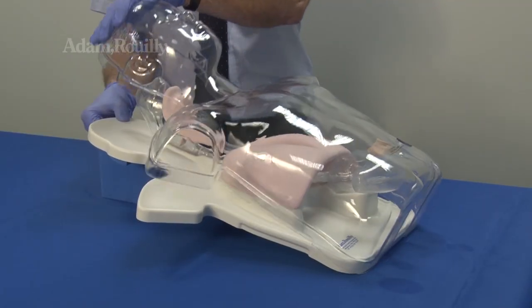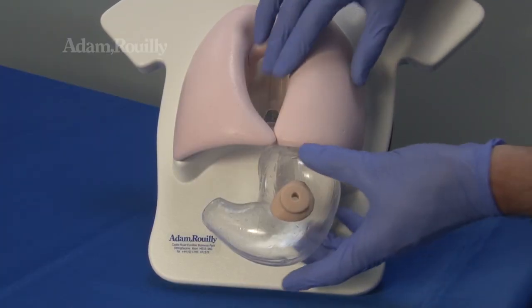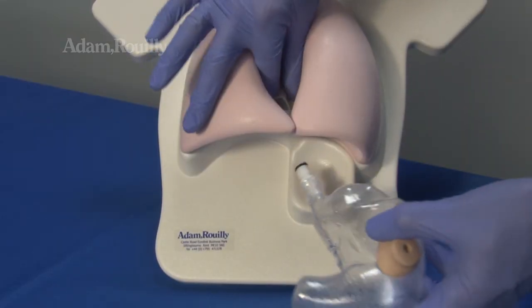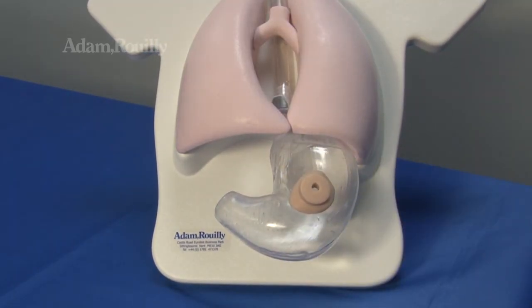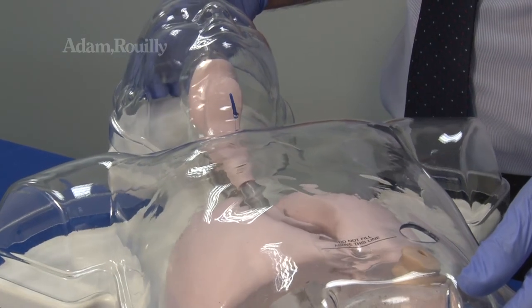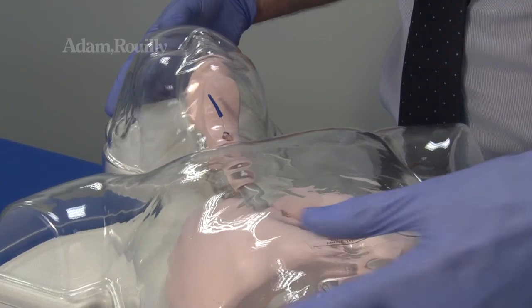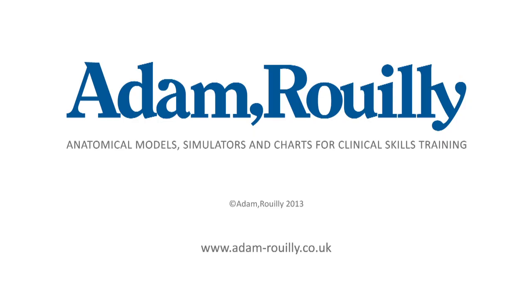After use, to clean or replace the stomach, remove the outer transparent cover. Press the grey quick release button on the connector and pull the stomach downwards to remove. To replace the stomach, locate the stomach tube into the connector and push until it clicks into place. Replace the transparent cover, guiding the epiglottis cord and gastrostomy opening.